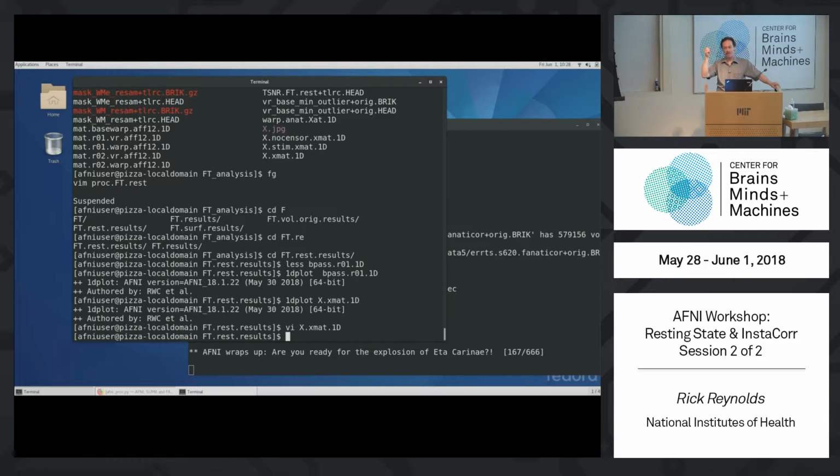50%, 20%, 10%, 5%. Oh, well, we're basically looking at, it's as if we had acquired 7 time points of data, and we'll do our correlation analysis on that. So that's what it can get down to. Even if this doesn't fail, you may just have a few degrees of freedom left. And it's as if you had acquired 7 time points. So you have to be careful with that so that you're not wiping out all your degrees of freedom.